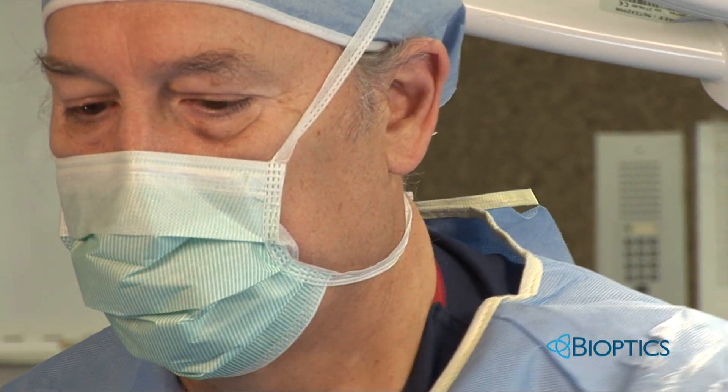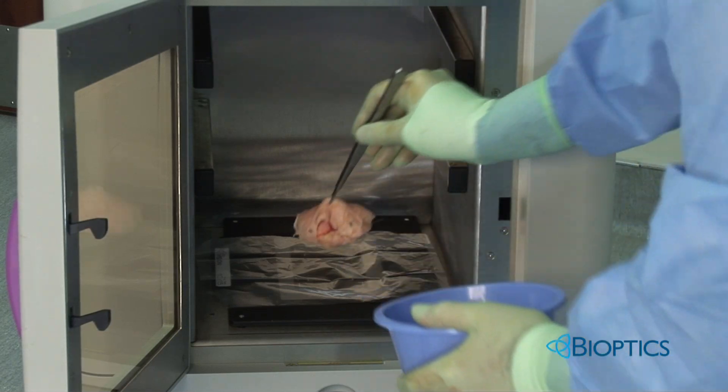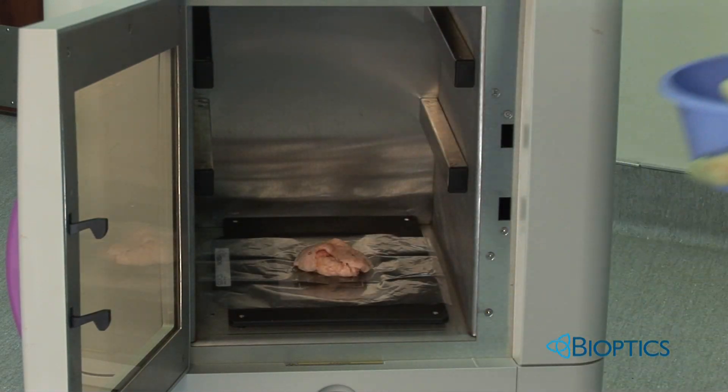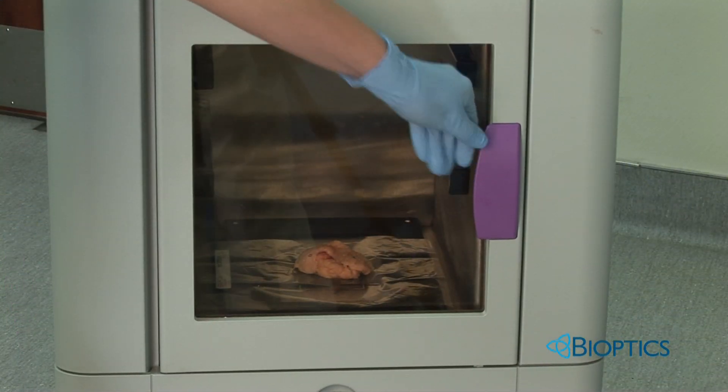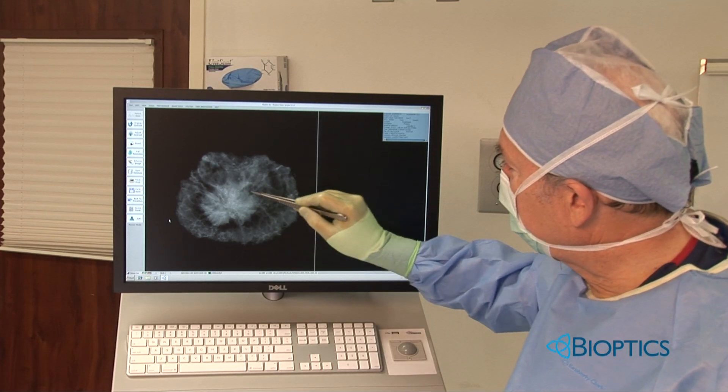Excise the specimen, place it in a specimen container, place it in the detector area, verify placement through the see-through window, push a button, and the image appears on the screen within seconds.